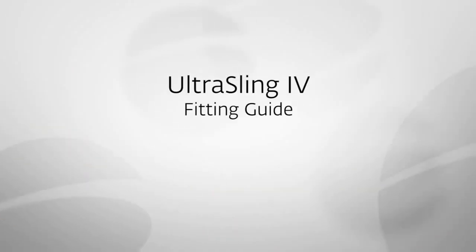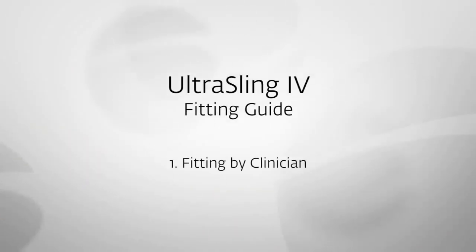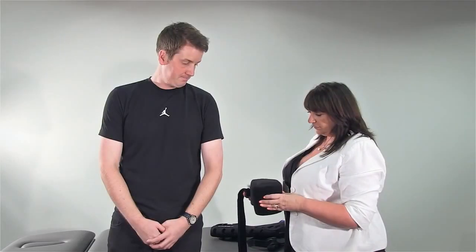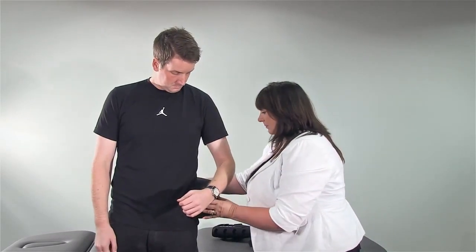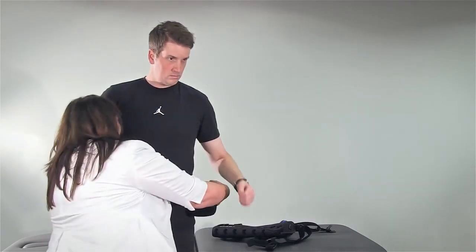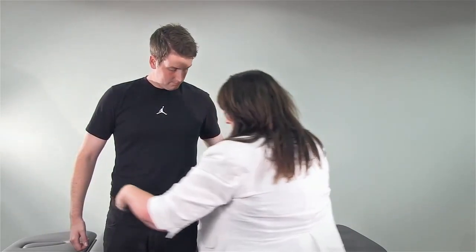We will now demonstrate the simplest way to fit the Ultra Sling 4, firstly when being applied by the clinician and then by the patient themselves. Start by attaching the cushion to the injured side at waist level, bringing the waist strap around the back and attaching it with the buckle at the front of the cushion.